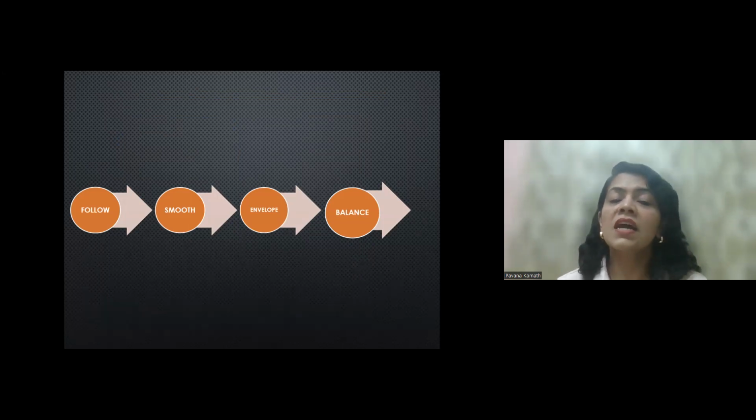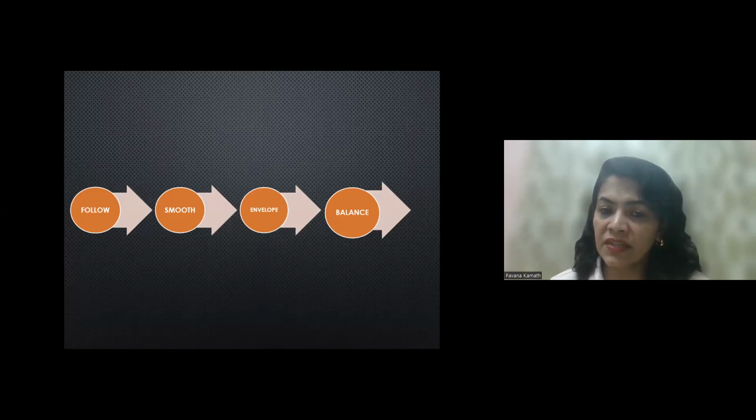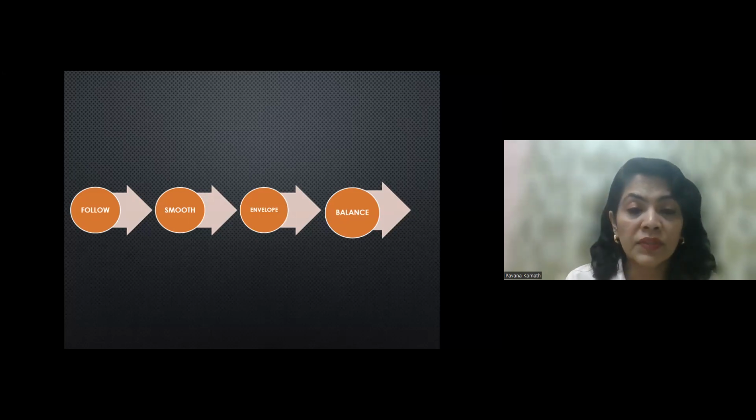What it means is that the glide path, which is reproducible, has to be prepared to a size which is one size larger than the first rotary instrument which is inserted for preparing the root canal.